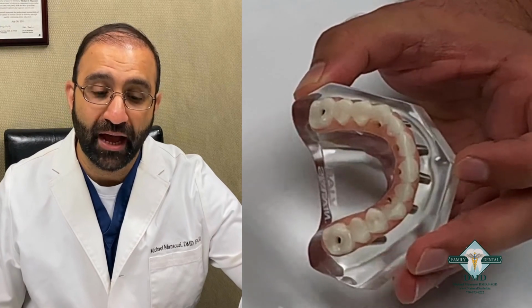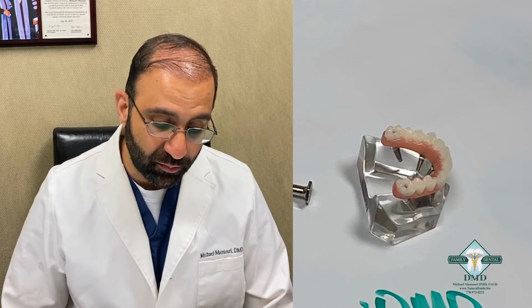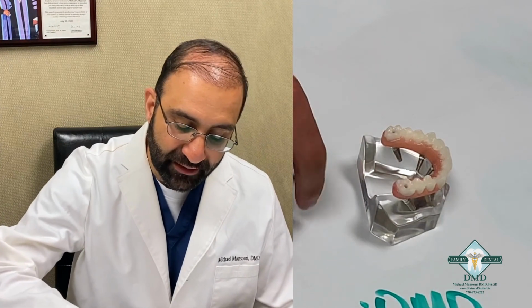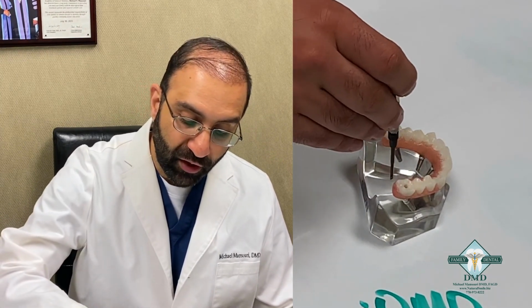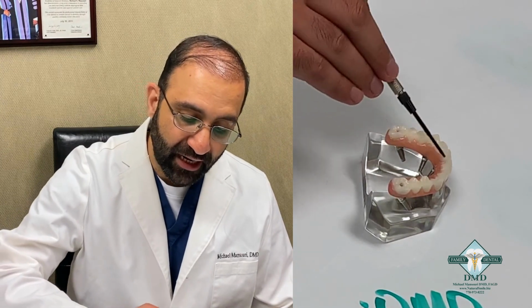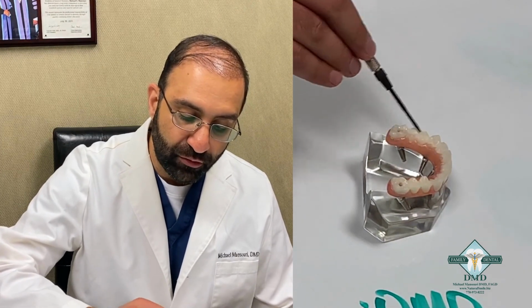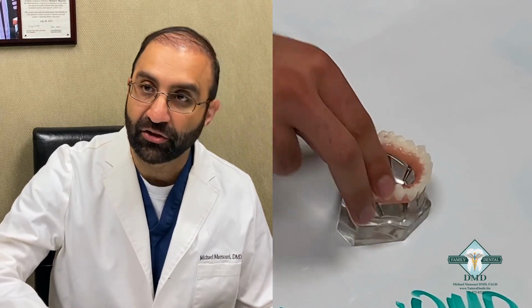That's why it's more important to have 5 or 6 implants rather than 4, to be stronger and more supportive. But the benefit of having teeth all in one day, or having a design that's similar like this, is you're no longer going to have that roof of the mouth component. For those that are familiar with dentures or a false set of teeth, you know that the roof of the mouth cover is very annoying and also makes you talk a little bit differently. And having a design like this will allow your dentist in future to remove this and show you how to clean underneath of it.